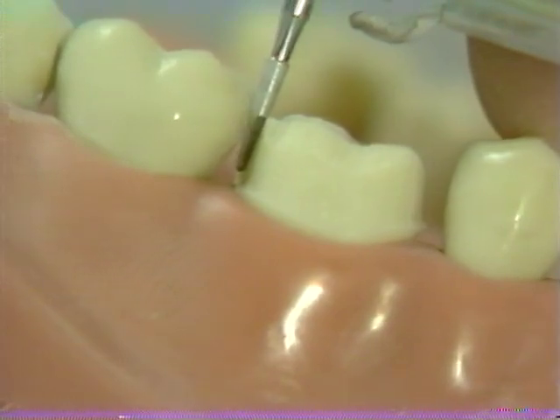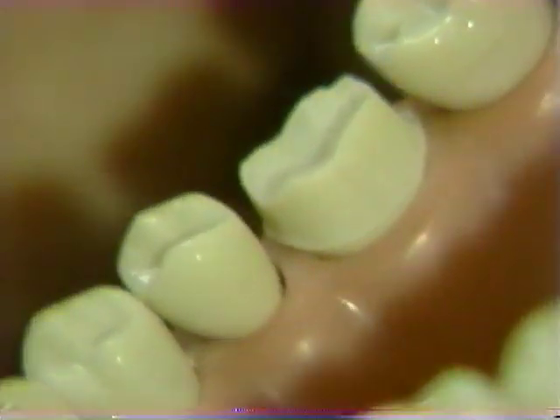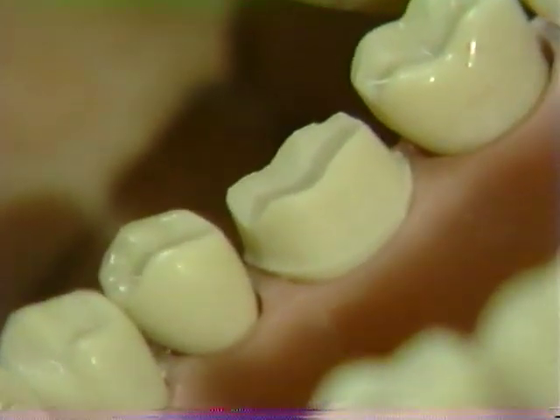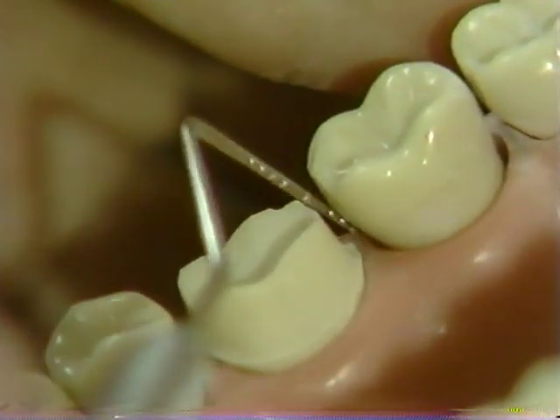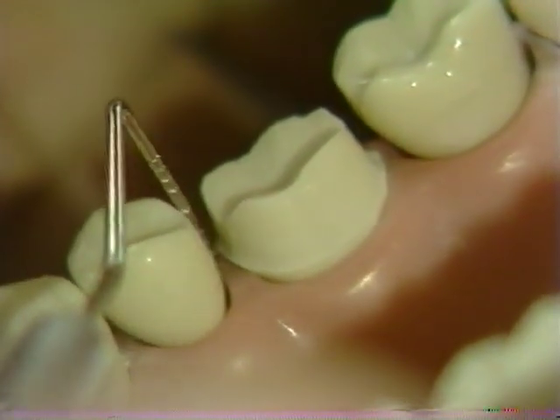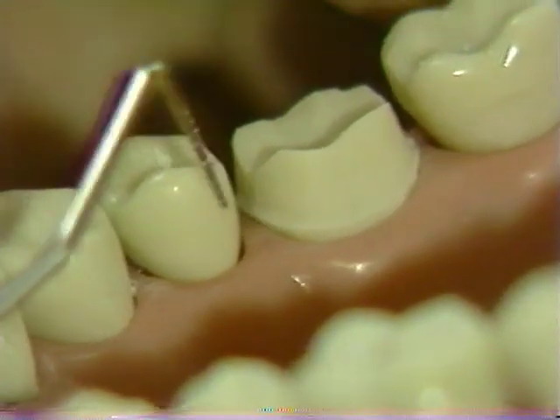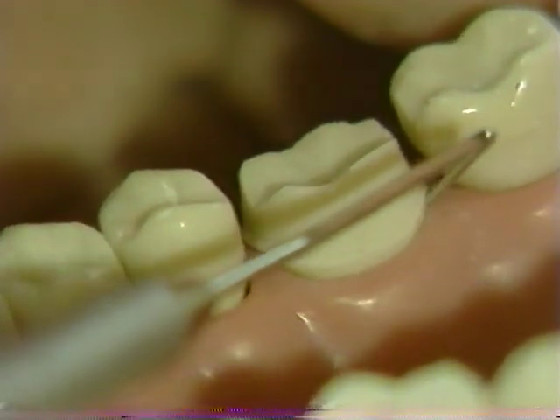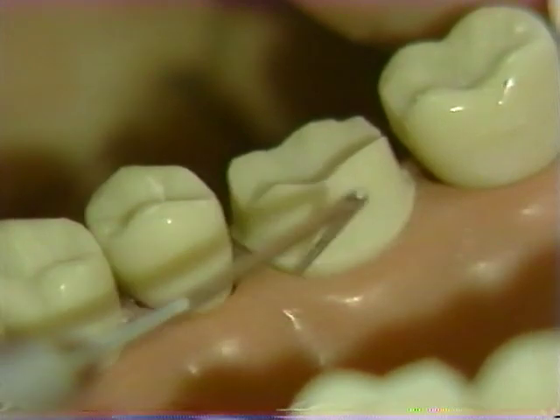A couple of passes will result in a smooth interproximal chamfer. At this stage, assess the adequacy of the chamfer and the reduction. Remember that clearance of at least one millimeter relative to the adjacent tooth must be obtained; otherwise, insufficient space is available for the impression material. Adjust the placement of your chamfer accordingly. Note that throughout this exercise, the margin will remain at least one millimeter above the pink acrylic resin.